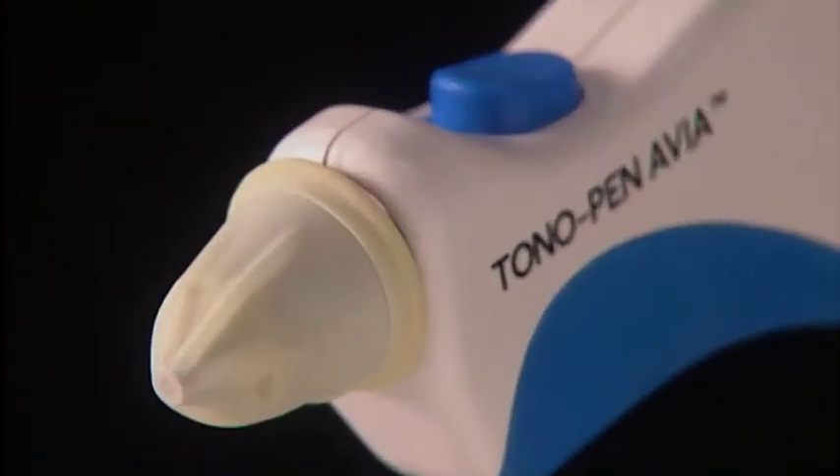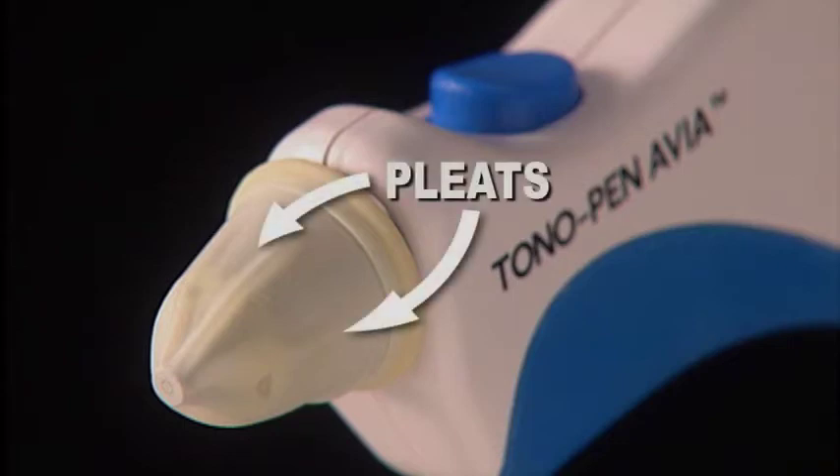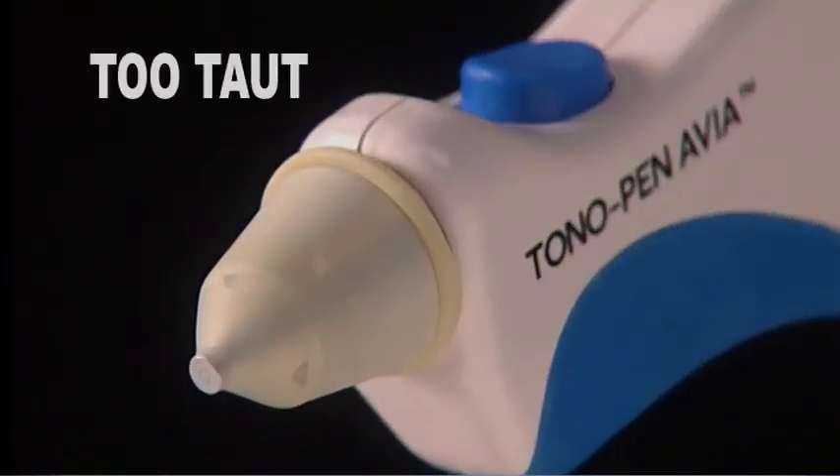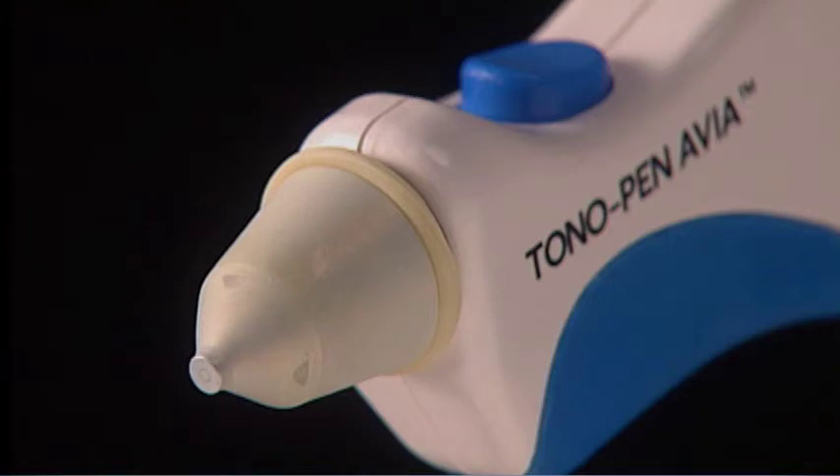This illustrates a tip cover with the proper tension. Pleats like these should be seen, indicating the correct tension and allowing the transducer post to move freely. If too taut, the Occufilm tip cover might introduce resistance in the micro movement of the transducer post, which could cause readings that are too high.